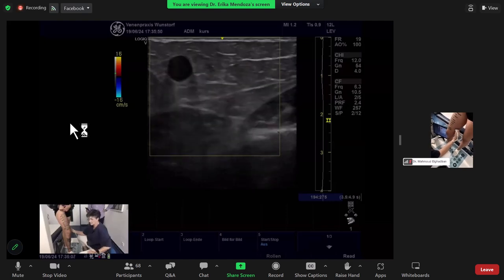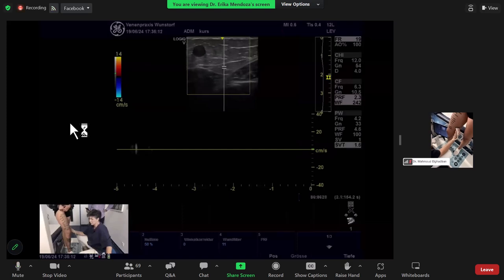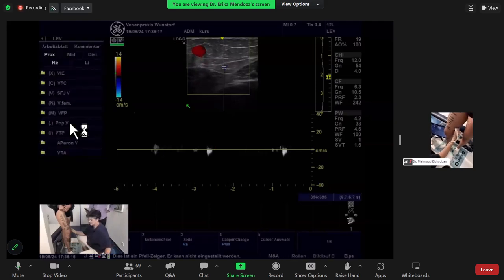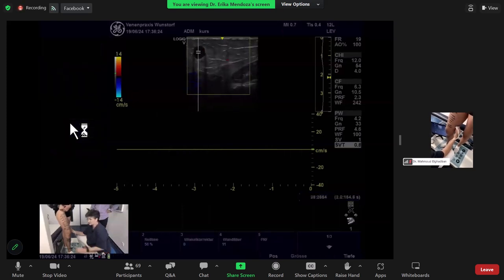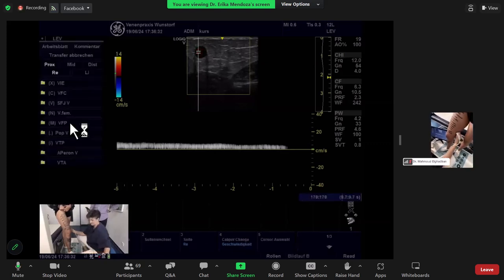Yes, but if you want to make a documentation of the reflux, you always have to do it with Doppler. Now I'm measuring in the saphenous vein here and showing there is no reflux. And when I go inside the tributary, you see a long-lasting reflux in the tributary, more than 2 seconds.